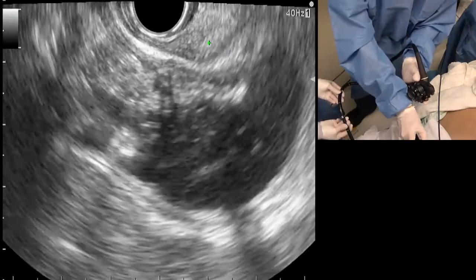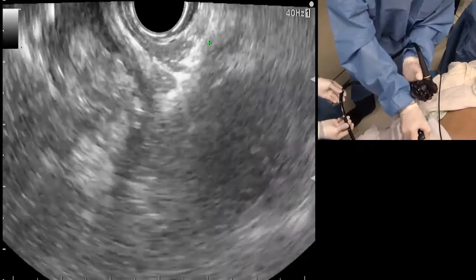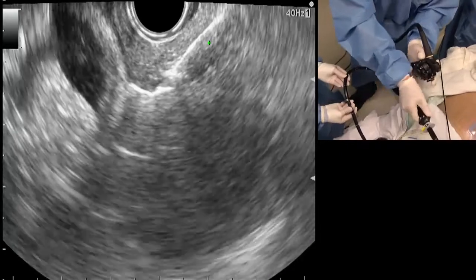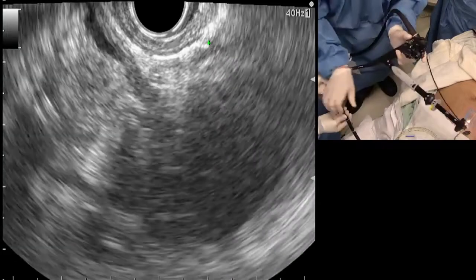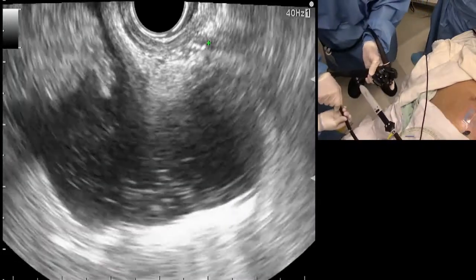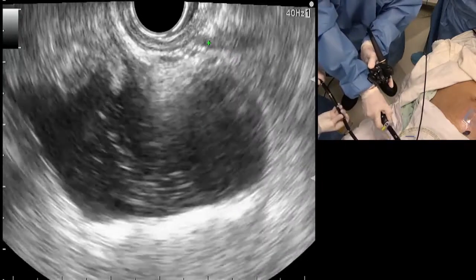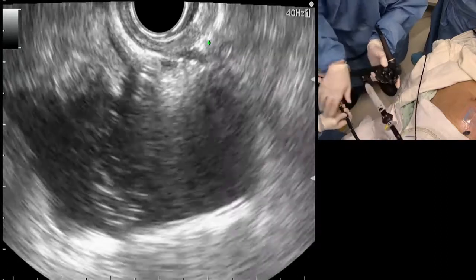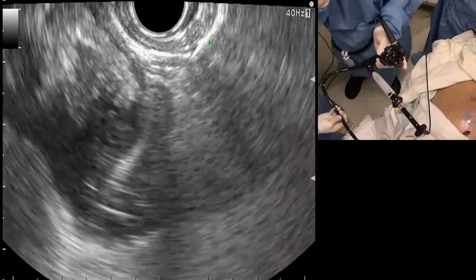So now I'm pressing on the pedal, cautery, and I'm pushing in. And there's some resistance. You see how it's pushing away? So 1 second, before I push this thing away, I'm going to pull back a little bit, and I'm going to try to recapture my view. This is a thick wall, and I'm going to push in again like this. And actually, I did pop in, but I need to see the catheter. There it is.